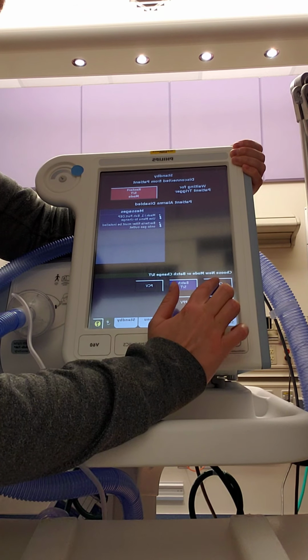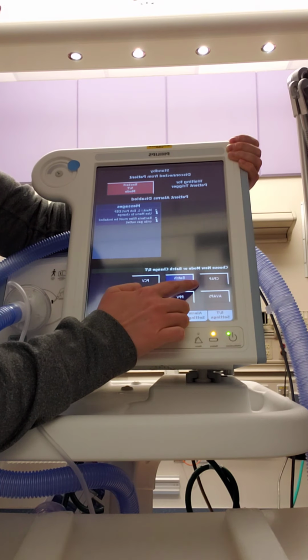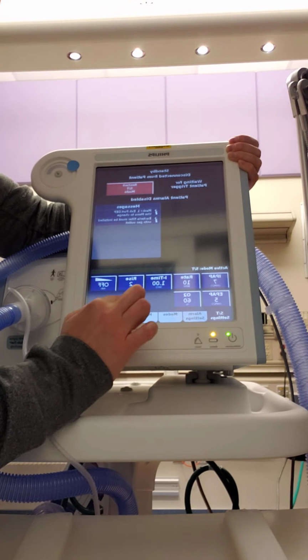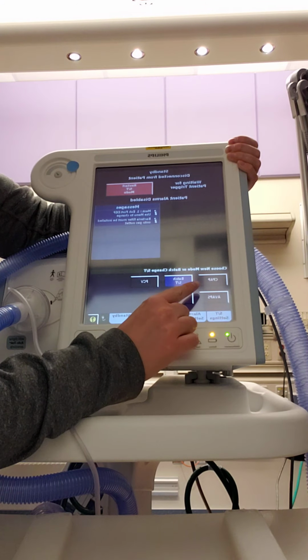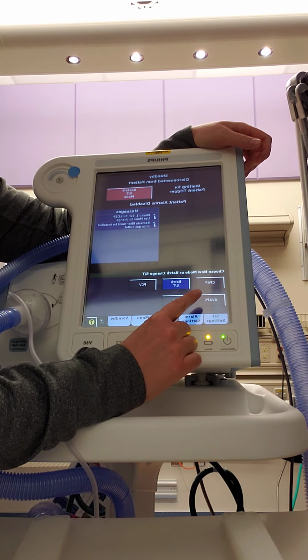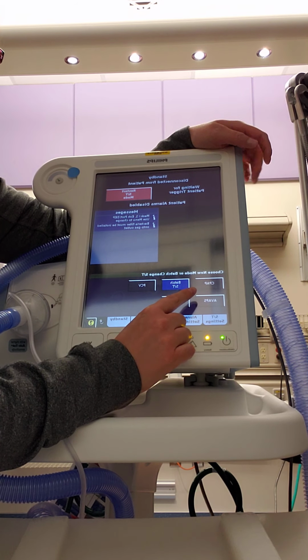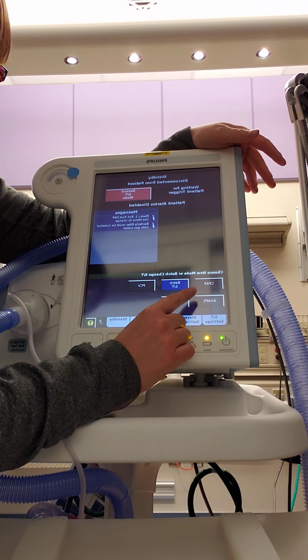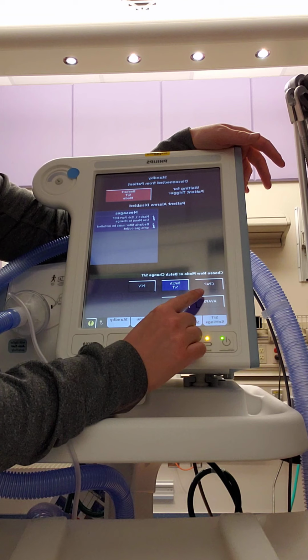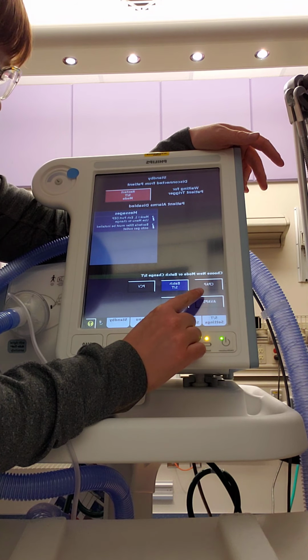We have CPAP mode, which stands for Continuous Positive Airway Pressure, and that is one positive continuous pressure. This can be used for situations such as oxygenation, where we have a patient with overwhelming atelectasis but ventilation is appropriate, where we just need to give pressure to open up the alveoli, or most commonly it is used for sleep apnea situations to stent open the upper airway.